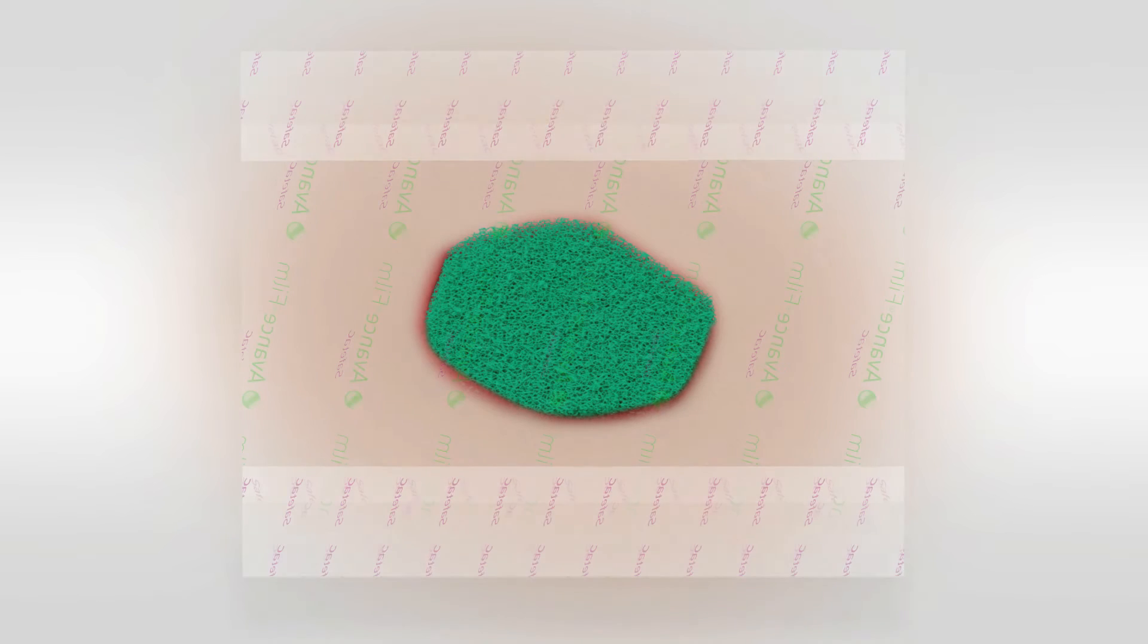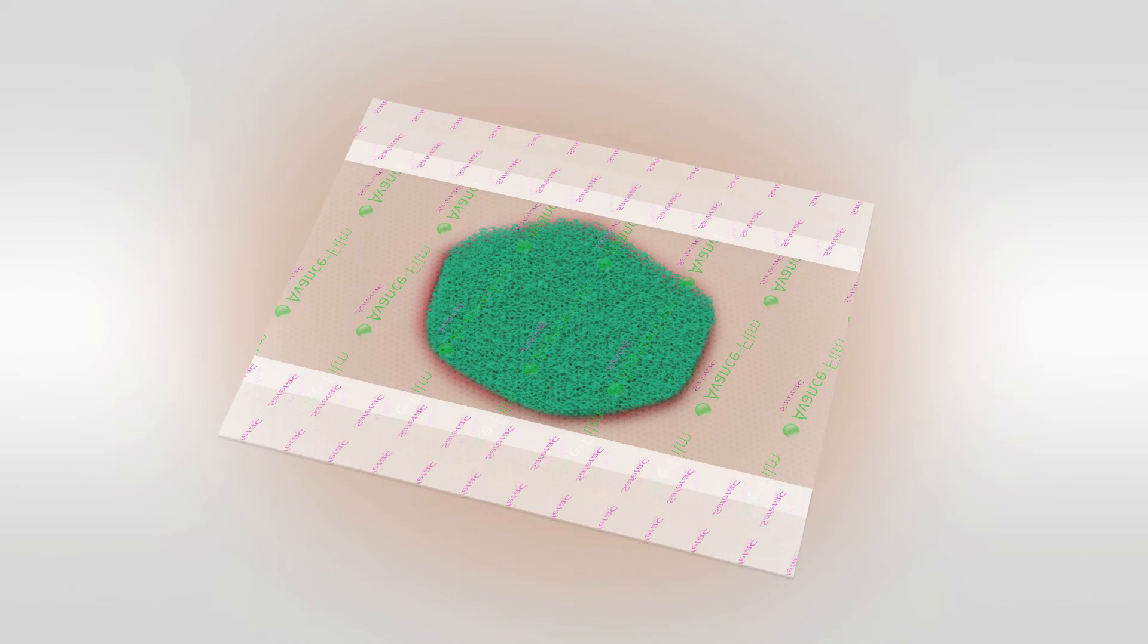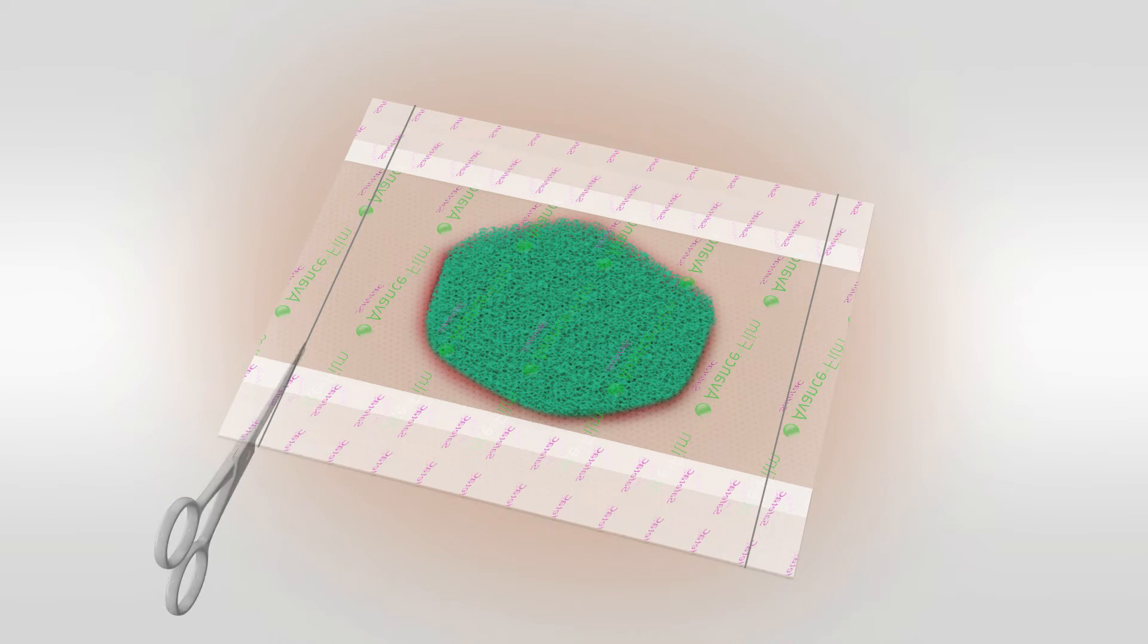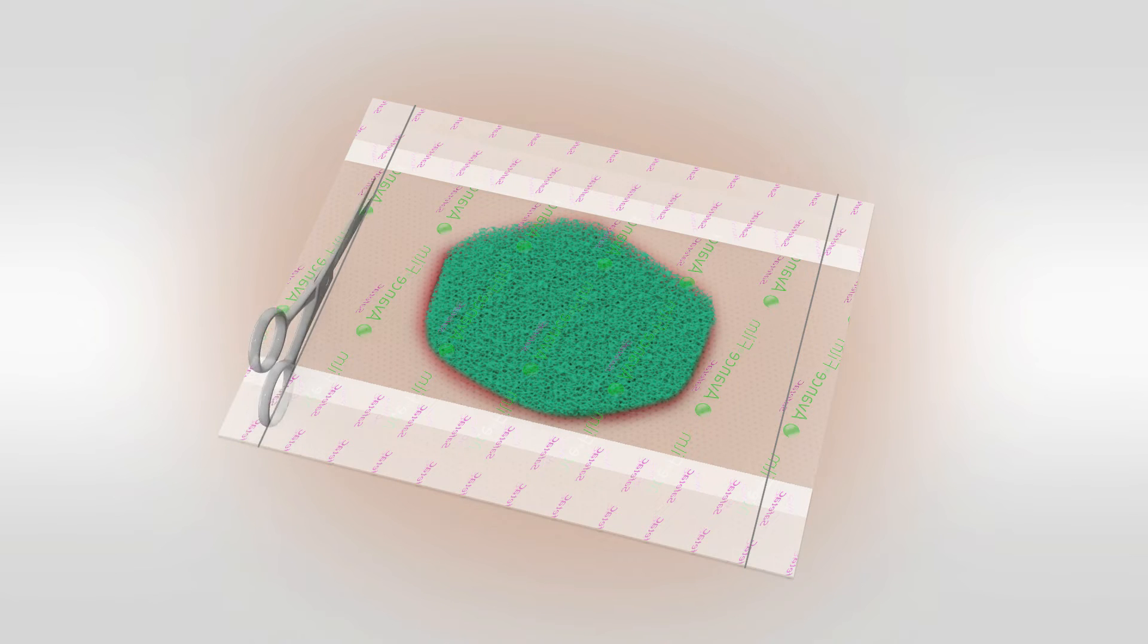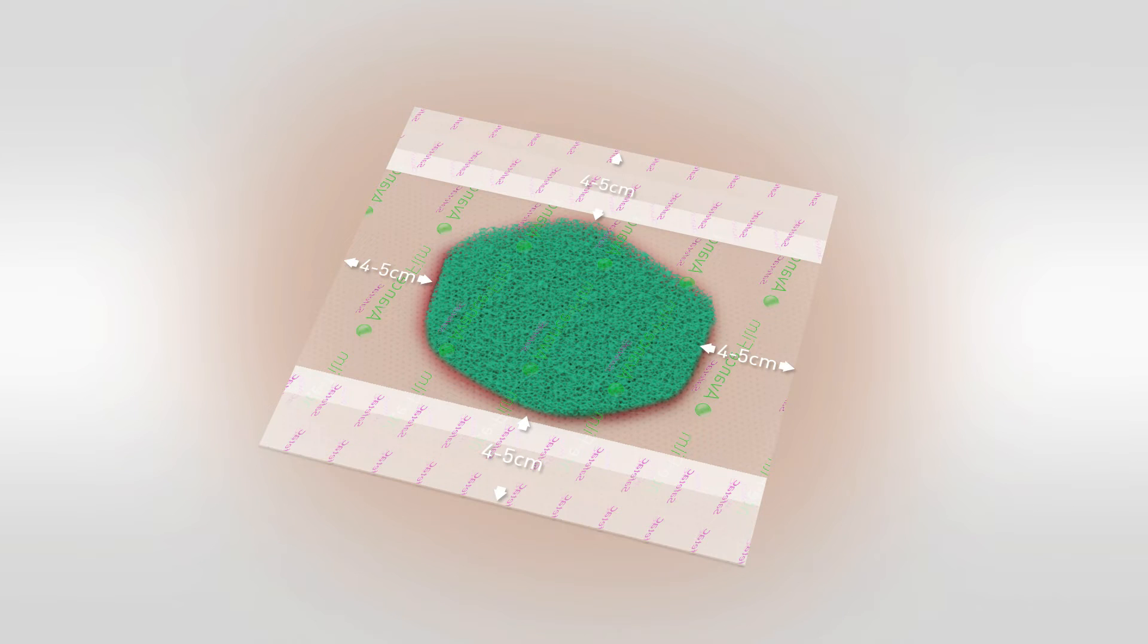Now, assess the wound and surrounding anatomy to determine if the film dressing needs to be trimmed, and make this adjustment before removing the release liner from the film dressing. Ensure a margin of 4-5 cm onto surrounding skin.